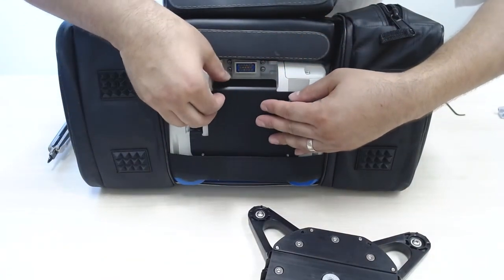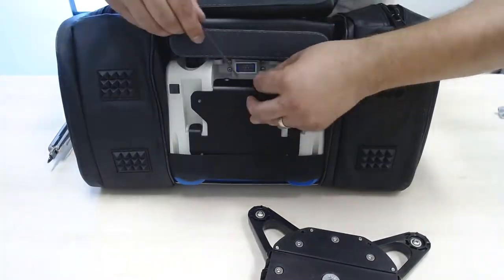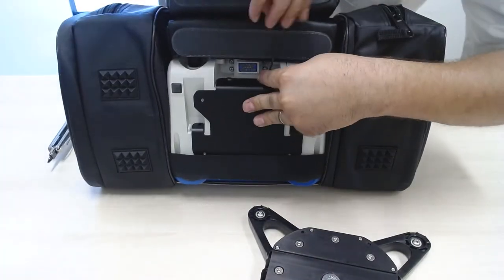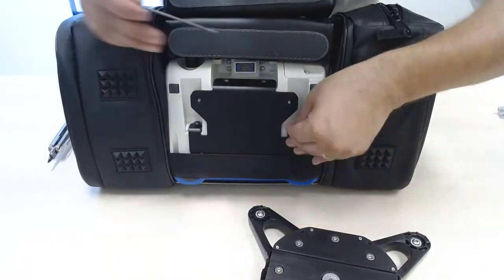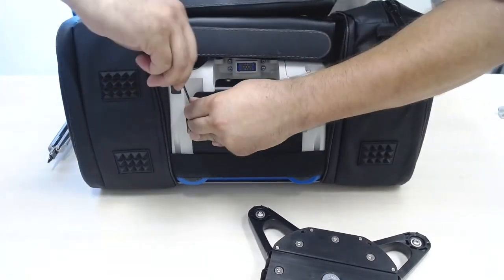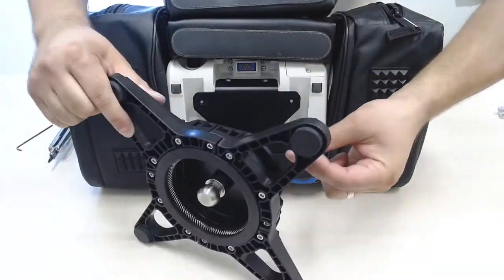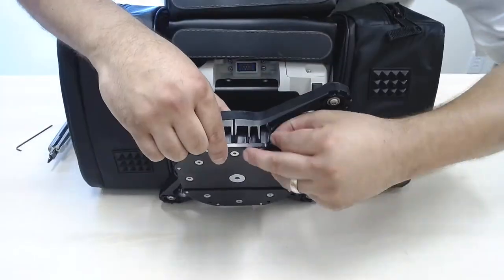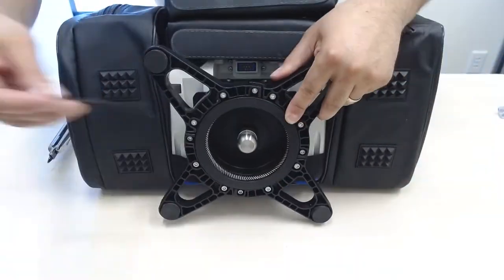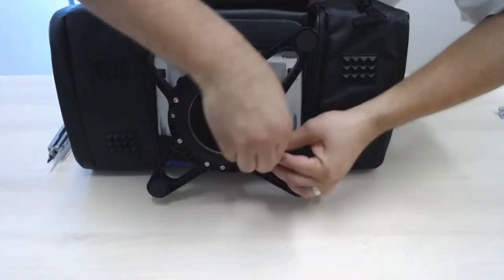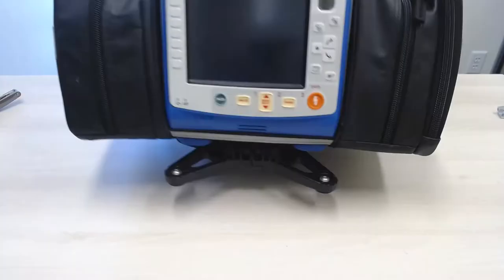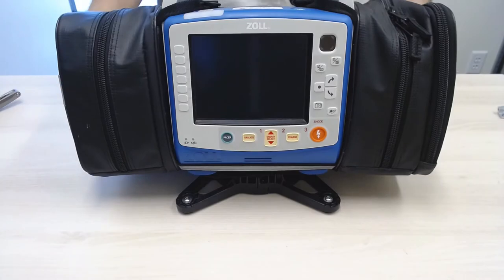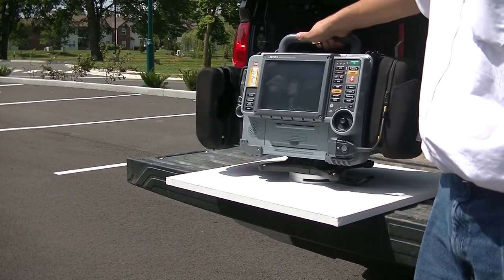Once the ZOL adapter is secured to the bottom of the monitor, the Snap interface can be secured to the adapter using four screws included with the kit. And that is complete installation of the Snap Mounting System of the ZOL X-Series monitor.